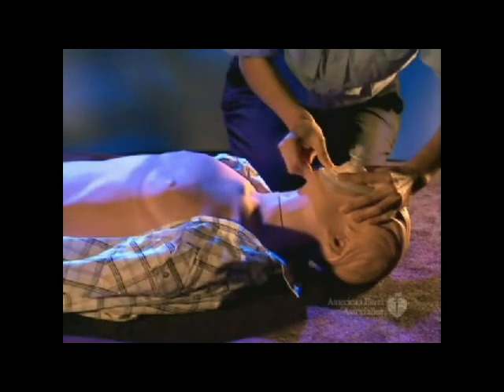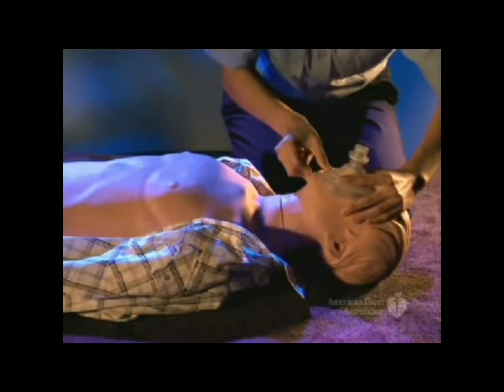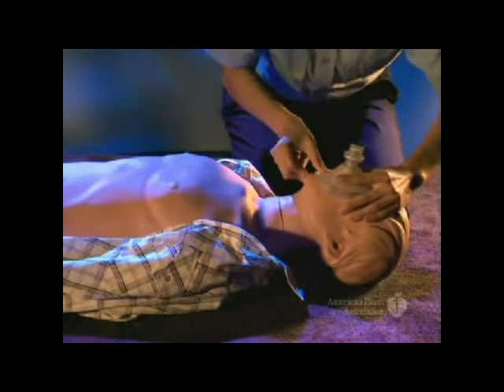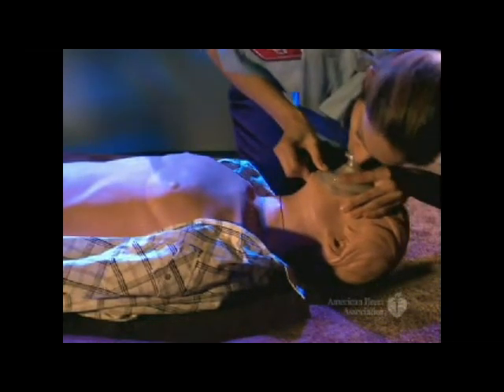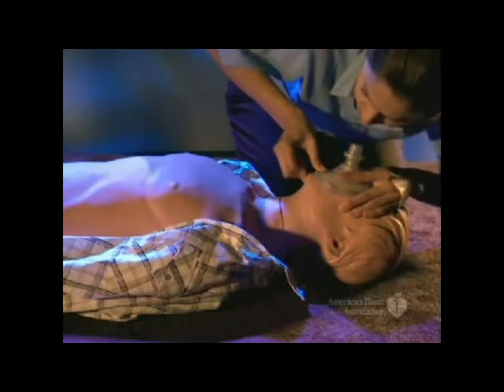Open the airway using a head tilt chin lift. Press the mask down and lift the jaw to hold the mask tightly against the face, and give 2 breaths while watching for chest rise. Each breath should be delivered over 1 second.